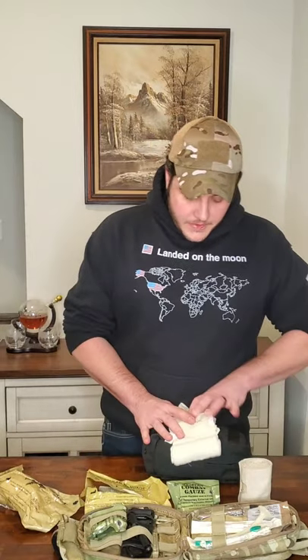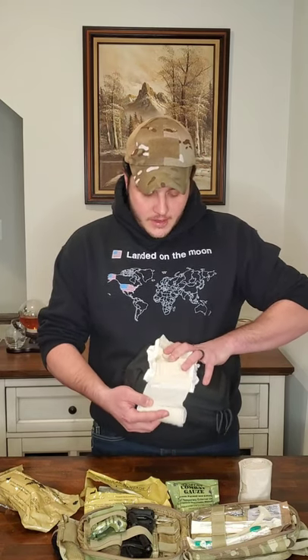The OLAES bandage has a wound covering on one side and a little plastic plate — when you wrap over it, it applies direct pressure exactly where you want it. While maintaining pressure on your gauze, place the bandage over the wound site. The first wrap is called a securing wrap — don't go too tight. You want that first wrap to hold the bandage and maintain pressure over the wound. If you crank it too tight, you may shift it, lose pressure, and the wound starts bleeding again.